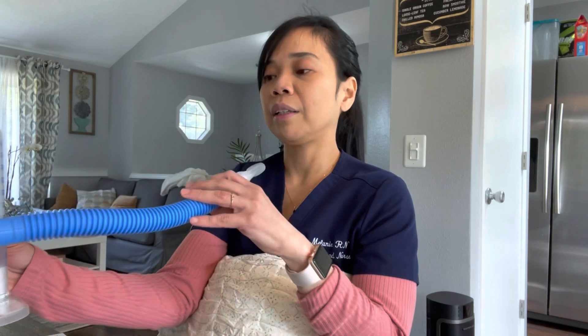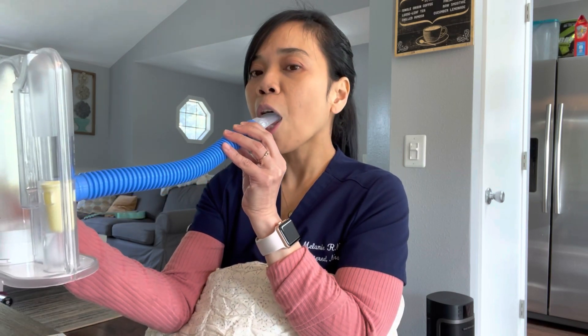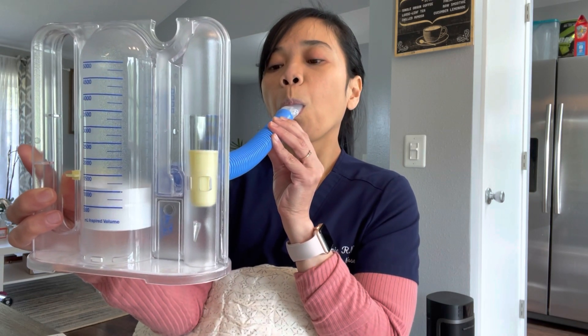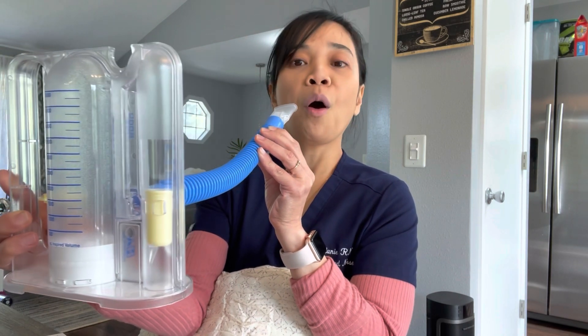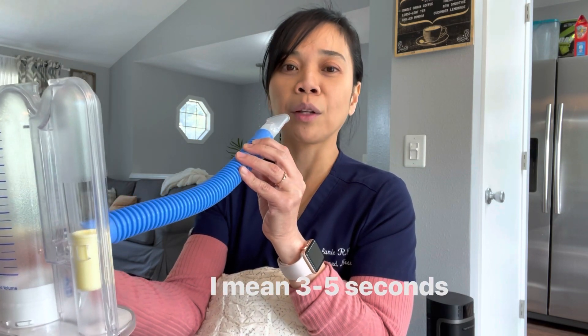Ask them to hold the incentive spirometer at eye level, seal the mouthpiece on their lips, and ask them to exhale first. Then inhale slowly and hold your breath for about three to ten seconds, or as long as you can hold your breath.